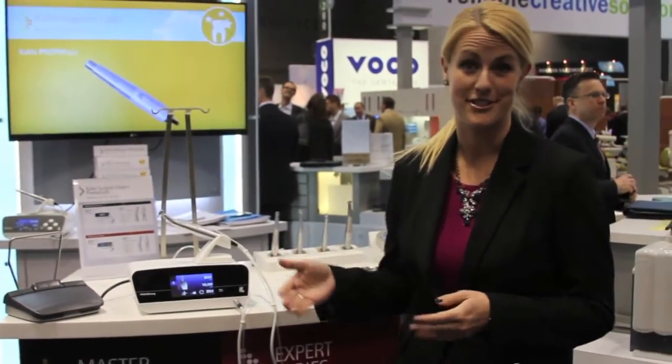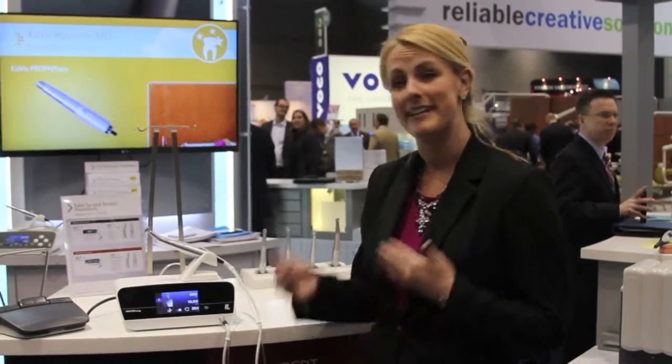The first product is our Master Surge. It's an implant motor that you can customize directly for your workflow and your everyday challenges for replacing implants.